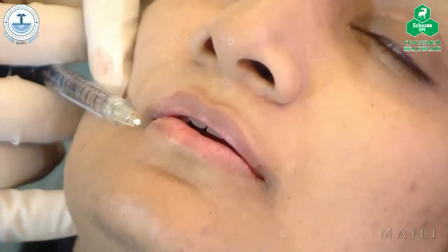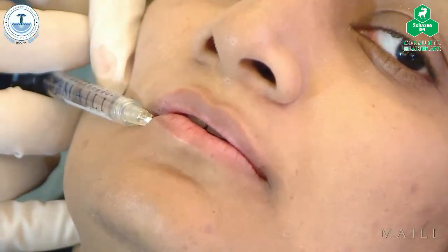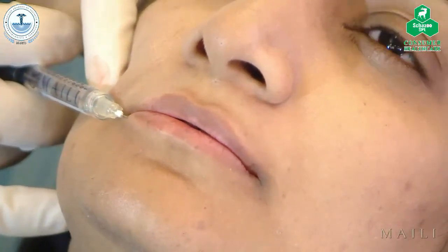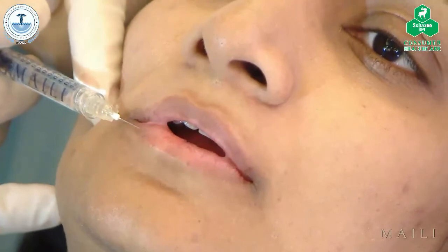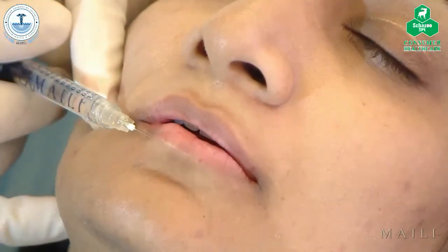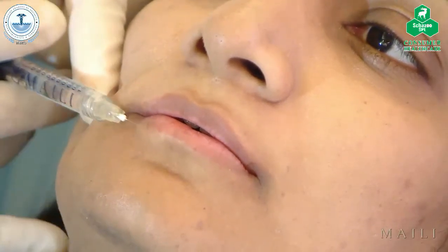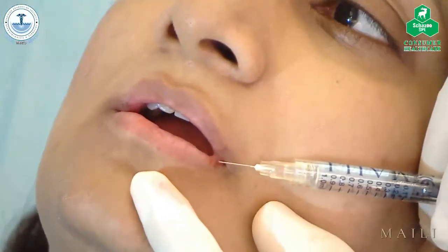This is precise. Previously, you were injecting precise or not? No, define. I was using define. Look, precise just gives a bit more of contouring. Look, just gets a bit more of definition there. Creates like a ridge. But without being a very hard ridge, which is what we don't want. The same thing here.